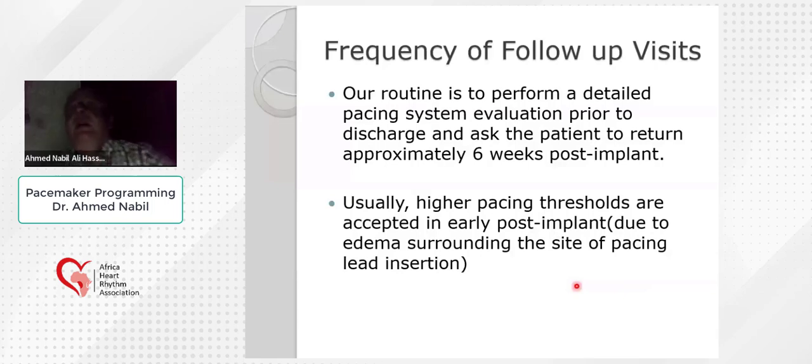Okay. The last thing to mention is how frequently follow-up visits or programming are needed for patients with a pacemaker. Actually, we should program the pacemaker on the day of implantation. And it is advisable to do another programming session before discharge of the patient.